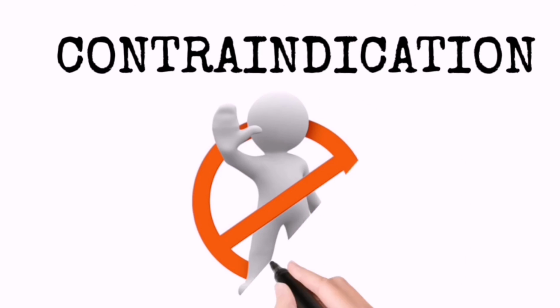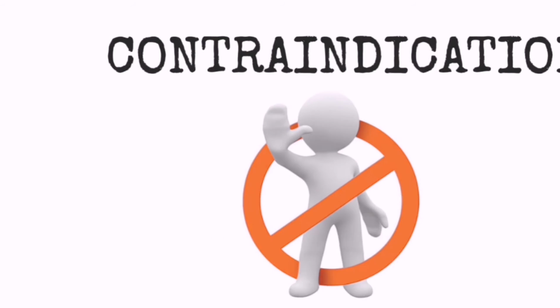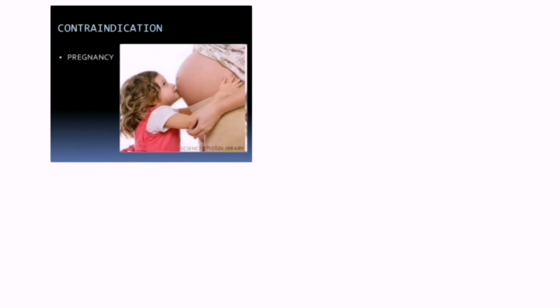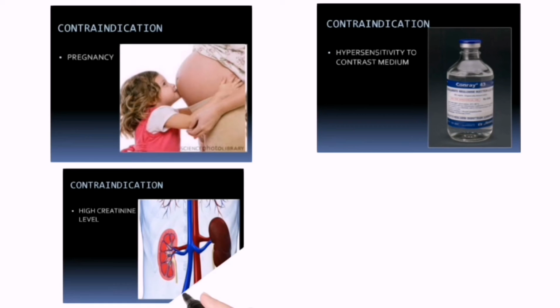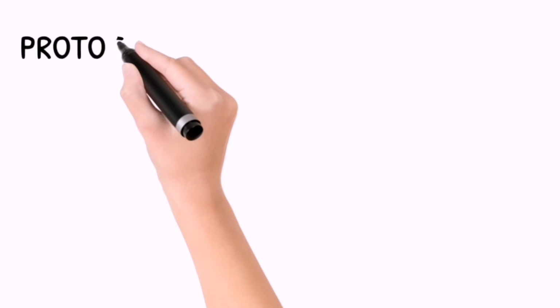What are the contraindications for a head CT scan? The following are the contraindications, such as pregnancy, hypersensitivity to contrast medium, high level of creatinine, and patient taking supplement or maintenance for diabetes such as metformin or glucophage.